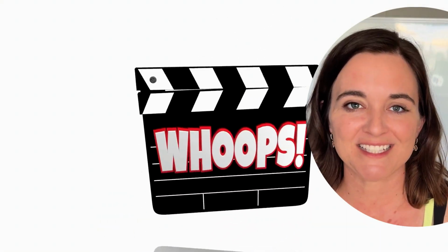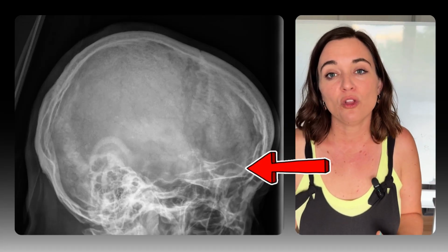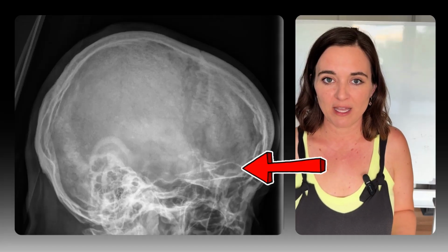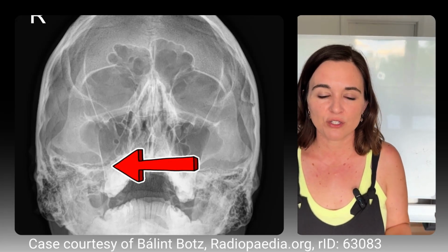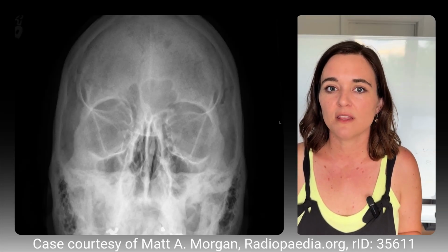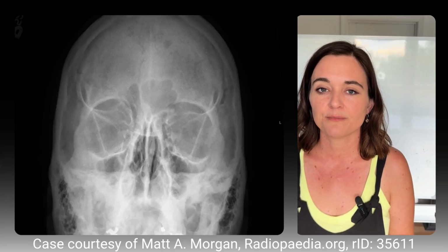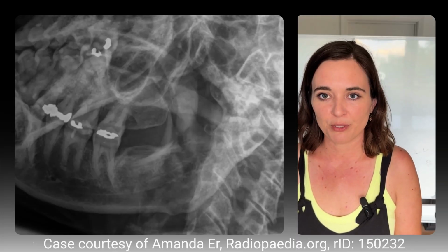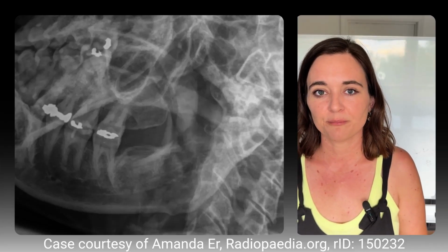Here's some common mistakes to catch. If you have rotation in your laterals, it will look like double orbital roofs or rami. If the petrous ridges are too high or low in the Waters view, you probably have the incorrect OML angle. If you missed sinus fluid levels, the patient's not upright or the horizontal beam was not used. If your mandible's superimposed on the spine, the head's probably not rotated properly in oblique.